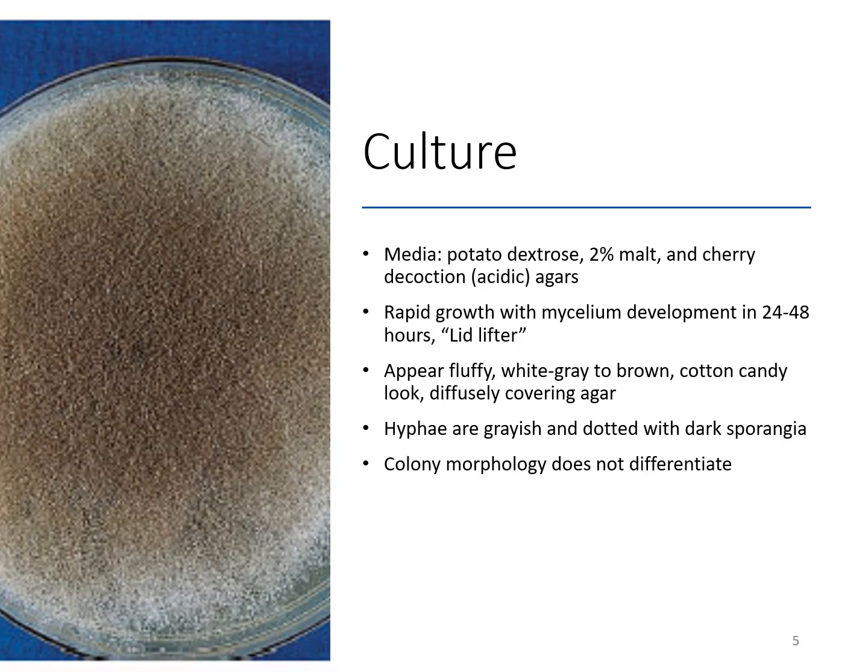These cultures do grow very rapidly. The mycelium develops very quickly, within about 24 to 48 hours. These are actually referred to as lid lifters because they grow so fast that they start actually raising the lid. Fungal cultures actually get a seal around them. That way, number one, it holds them tight, but number two, it also prevents any of these spores from leaching out from around the edge of the culture lid.